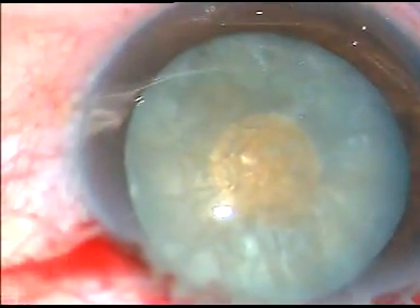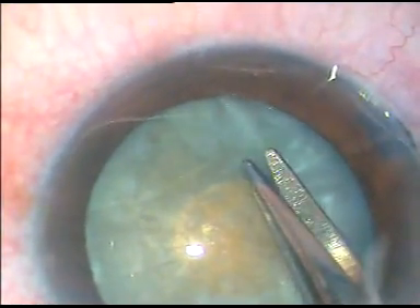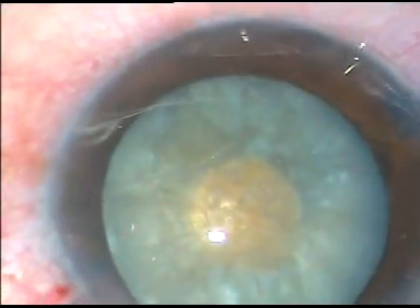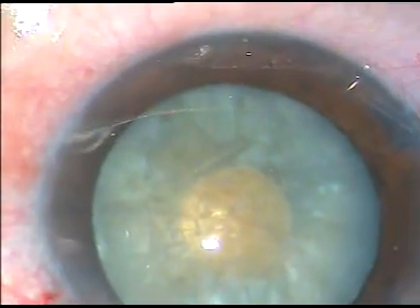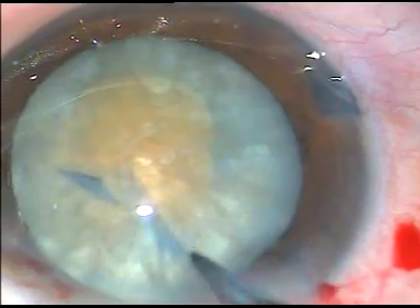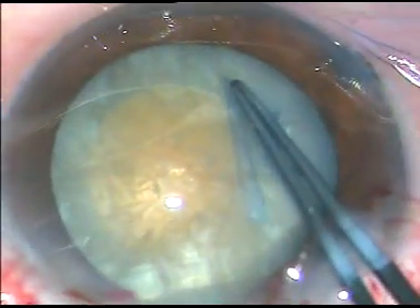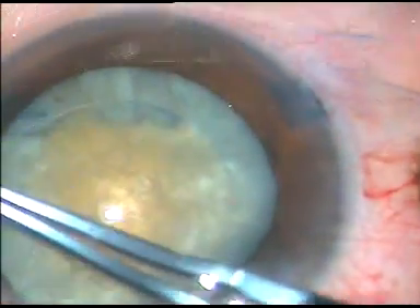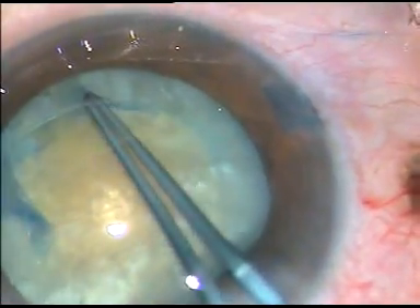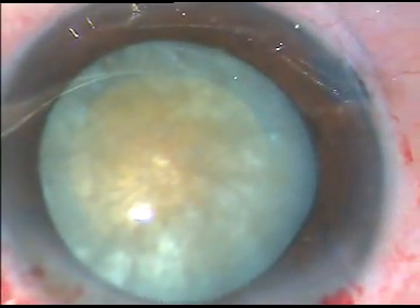Now, HPMC is injected again and then a nick is made at the margin of this small rhexis. Rotational force is used and an adequate-sized rhexis is completed in this way. That's it. So if you don't have a femto, this is the way to go.